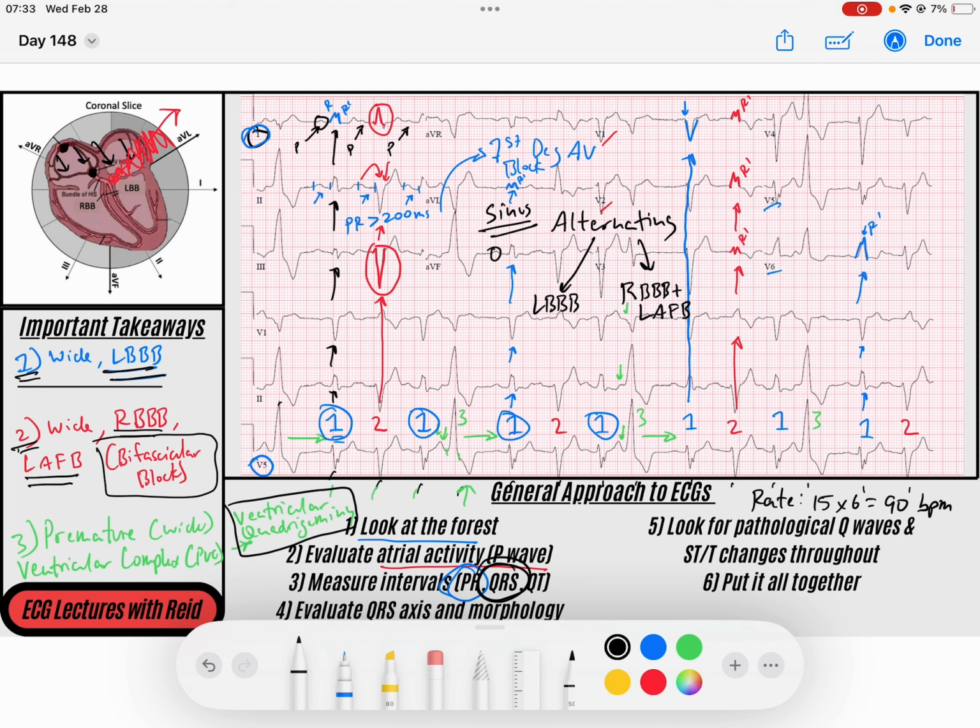They likely are going to need maybe even more advanced imaging, cardiac MRI, cardiac catheterization, because you might think this is probably due to severe underlying coronary artery disease, where this individual has probably got some chronic ischemic changes that are damaging the tissues and altering their ability to recover on time. And so that's why you get these alternating morphologies.